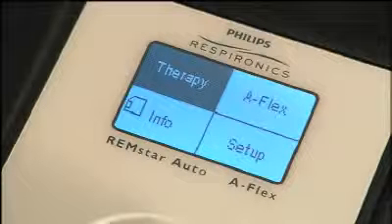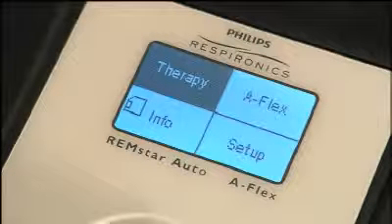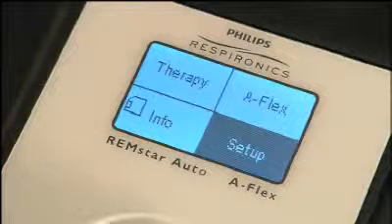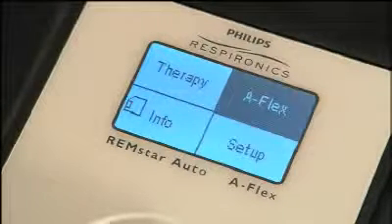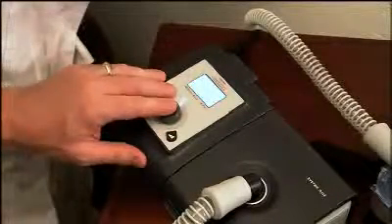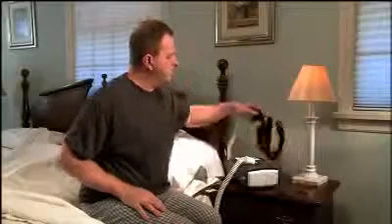When the device is ready for use, the home screen appears on the display. From this screen you can select therapy, flex, info, or setup. Turn the control wheel to highlight therapy, then press the wheel in to turn on the airflow and start therapy. The pressure currently being delivered is displayed.